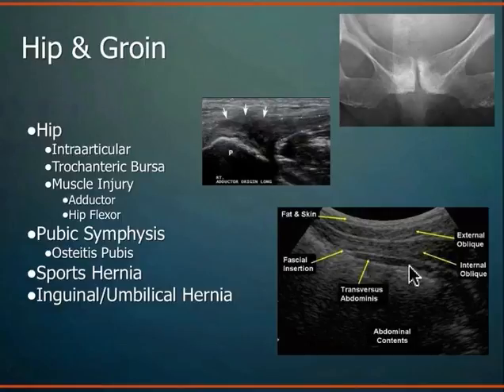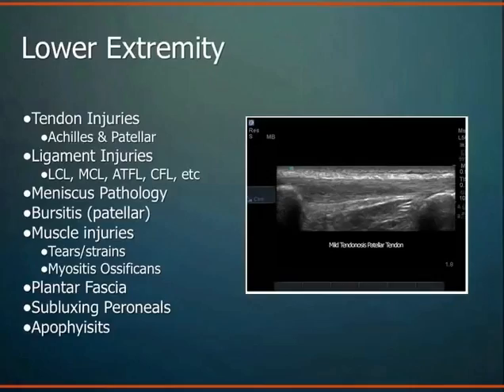with ultrasound. Another very common source of pain in the groin, in athletes particularly, is osteitis pubis, or just chronic changes and inflammation at the pubic symphysis. The best way to work through your differential on that is to inject it. It's obviously a sensitive area, so you want to have image guidance to inject. You can see it quite well on ultrasound and use ultrasound guidance for those injections.